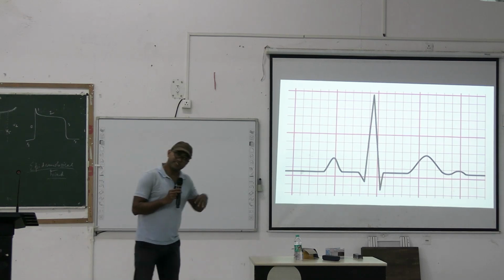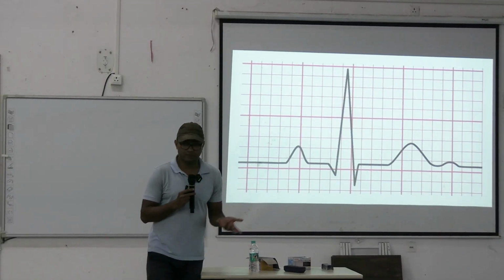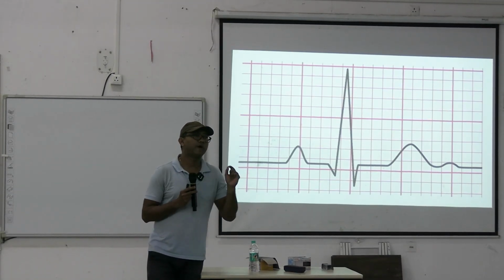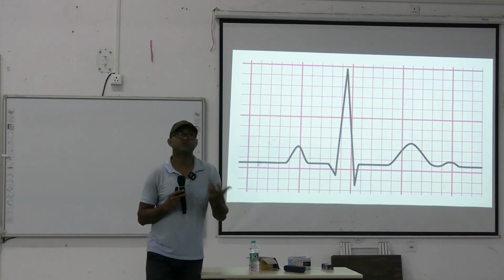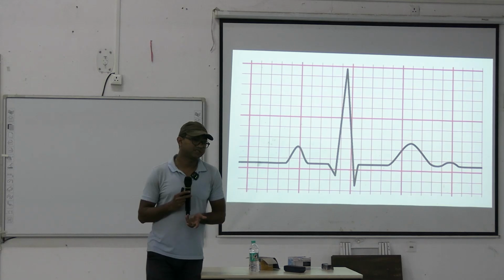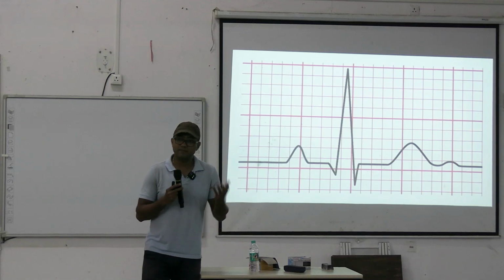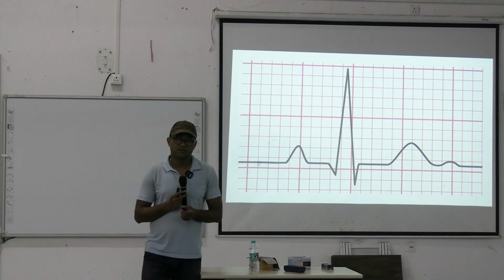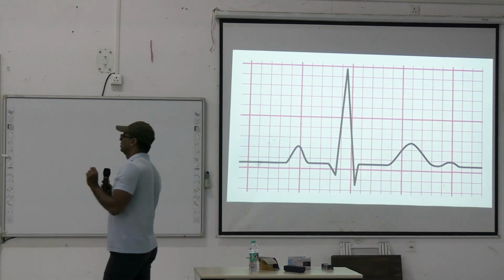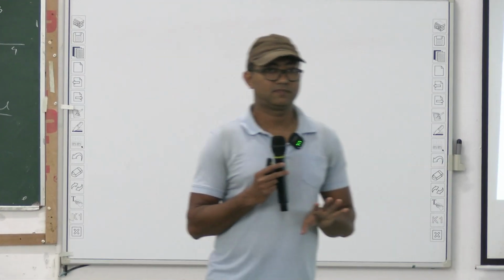Okay. So, that essentially means the atrial depolarization wave or the action potential takes 0.16 second time to reach from atria to ventricle, okay, because P wave is atrial depolarization, QRS complex is ventricular depolarization. So, the time gap between atrial depolarization and ventricular depolarization, okay. So, the time duration from atrial depolarization to ventricular depolarization is PR interval, okay.